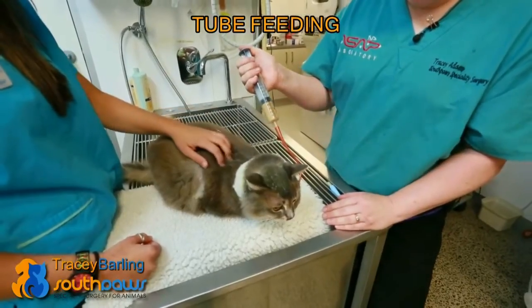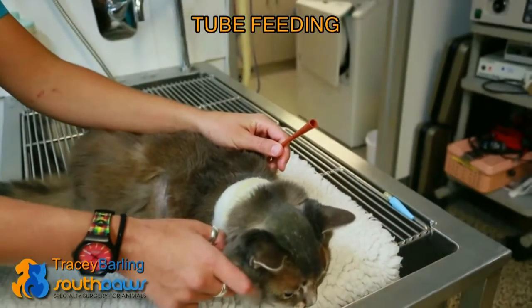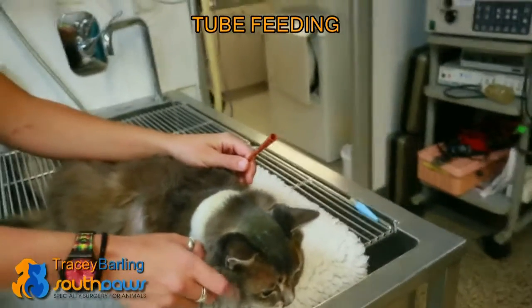When we place the tube, we take an x-ray to ensure that it's in the right place. When we place a feeding tube, it always has to stay in for at least a week, even if the cat is eating by themselves.